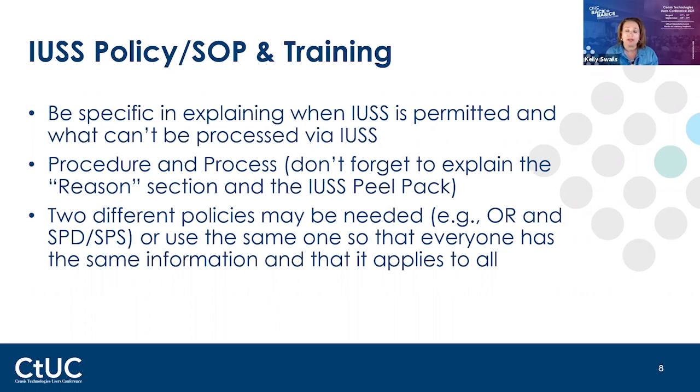Along with that then is when is it permitted? One thing with CensiTrac is I recommend using the instrument search. So if you're in a case and let's say you're doing a thyroid and the green goiter gets contaminated and you need another one and you don't have another radical neck tray, go into instrument search and type that in there. Well, little did you know, Dr. Smith has one in his foot and ankle tray for some reason.